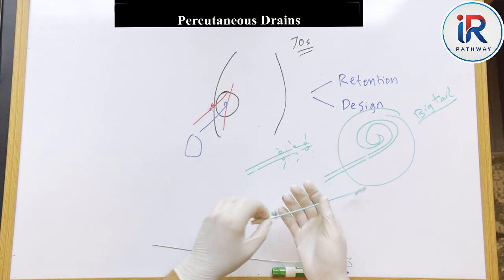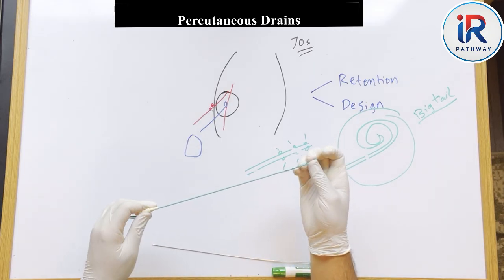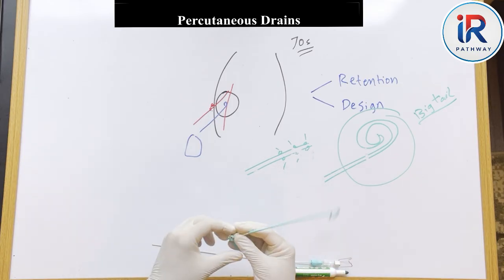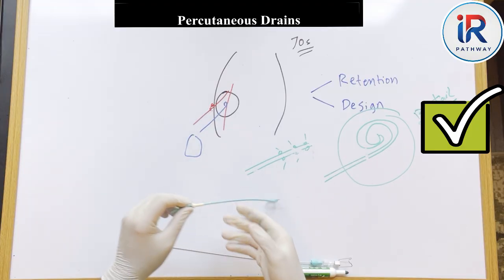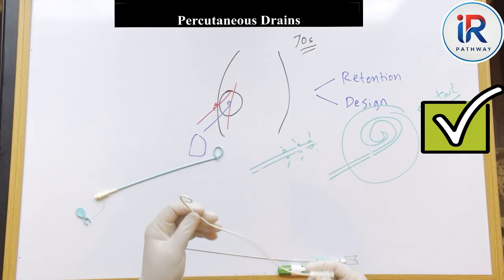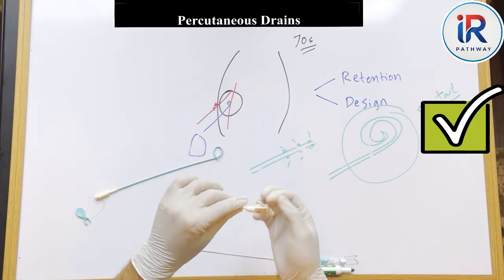Of course, there are different types of catheters. This one, for example, is the Skater catheter from Argon. Many companies manufacture these drains, and most of them work very well. The retention mechanism may vary from one brand to another, but in this one, for example, it's controlled by a string that wraps around, while in other companies like Cook, for instance, the drainage system is slightly different, like this one.